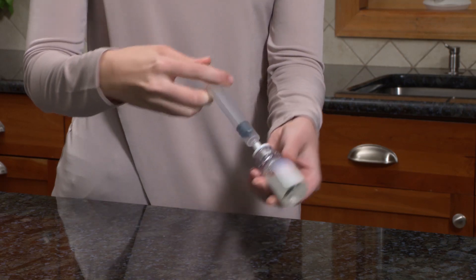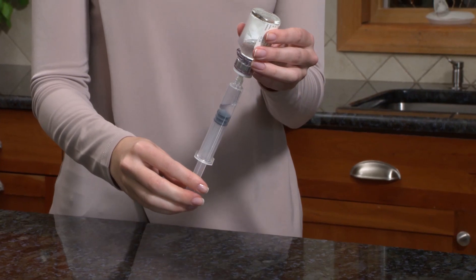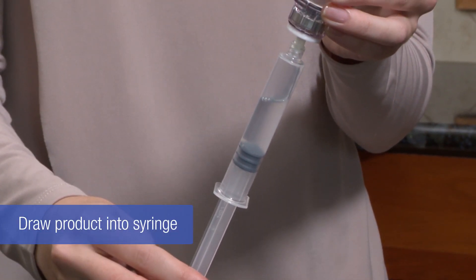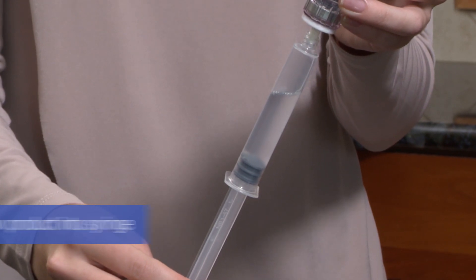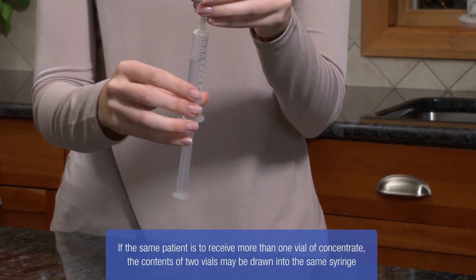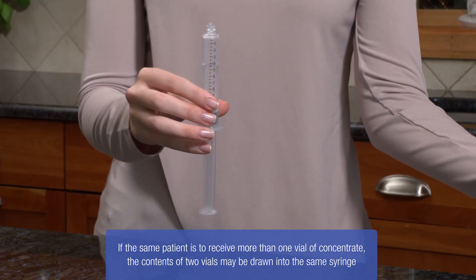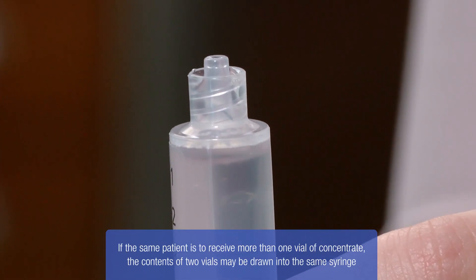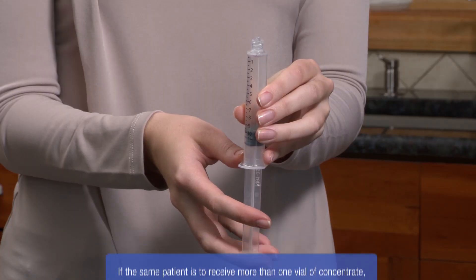While keeping the syringe plunger depressed, turn the product vial upside down and pull the plunger back slowly to draw the product into the syringe. Unscrew the syringe from the mix-to-vial. Hold the syringe upright and push the plunger down to push out all the air. Now your factor is ready to use.